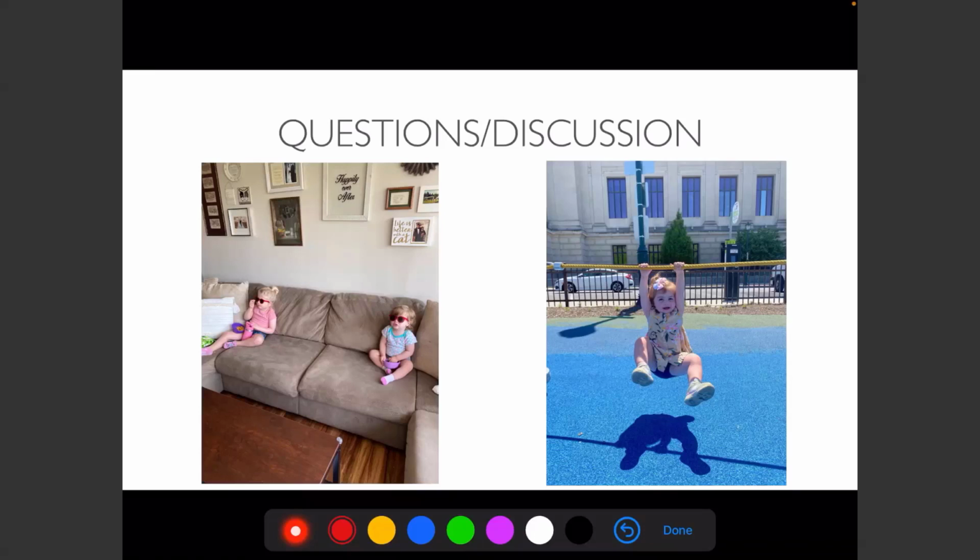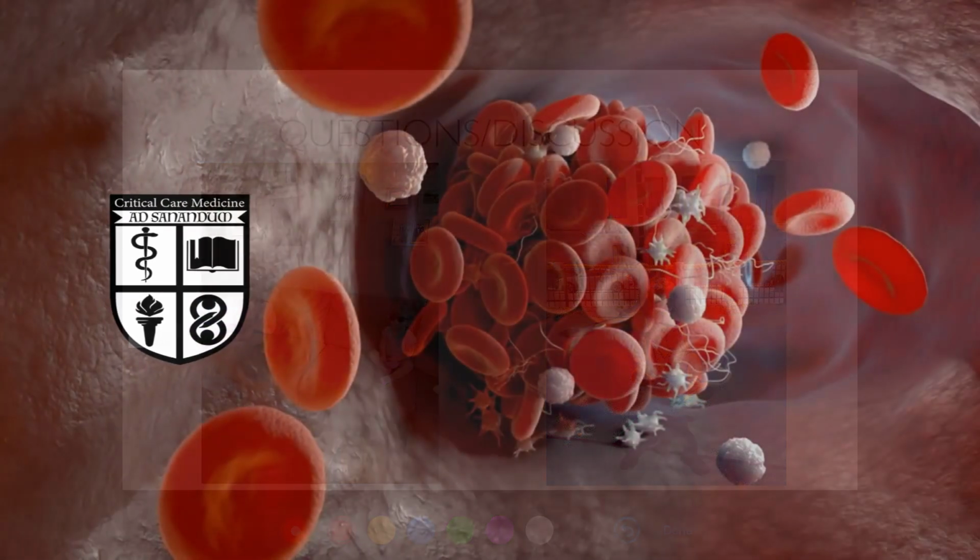I think fibrinogen's turnaround time is slow. Yeah, especially with how long it takes to get cryo. So you have to wait an hour and a half to get the lab value, then you order your cryo, then maybe it's hanging in an hour and a half, 2 hours. Especially in obstetric hemorrhage, particularly low fibrinogen values. I didn't have time to go into the pathophys behind that, but a lot of the papers said the same thing, that they universally will have lower fibrinogen. So I just think it really changes management in a lot of different situations. You just have to commit to learning how to use it.